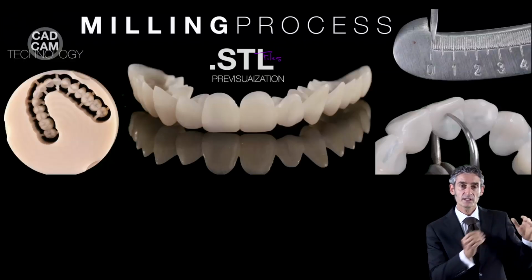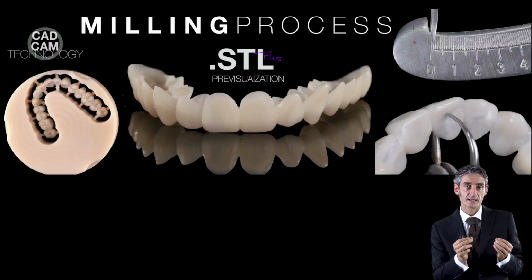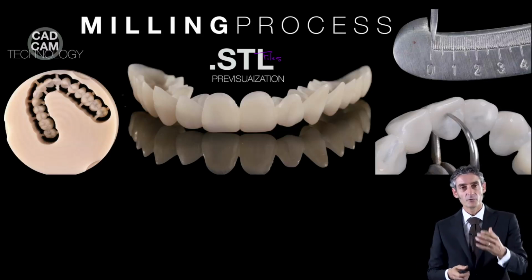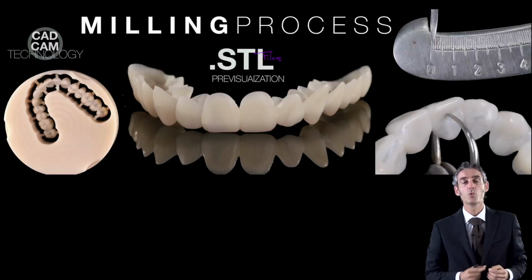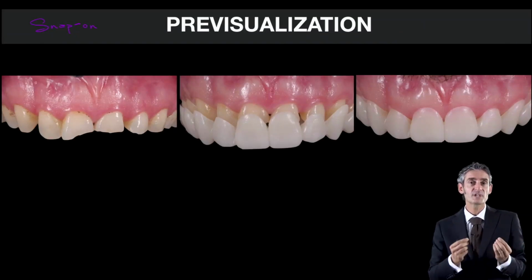And so look at here, this is what we can do. So we can mill with the PMMA something that can overlap our dentition without any kind of preparation, and then we can understand the new aesthetic. Remember that in cases like this we can mill easily till 0.1, so really thin. And you can see that right now with this kind of snap-on mock-up, in 2 seconds we can fix it in the mouth, as you can see here.